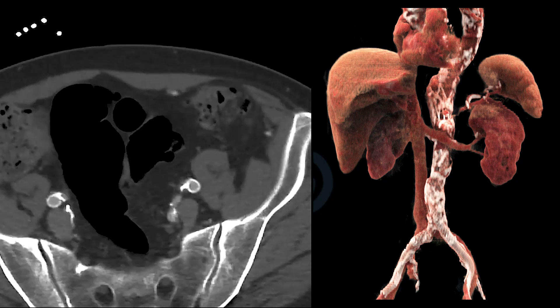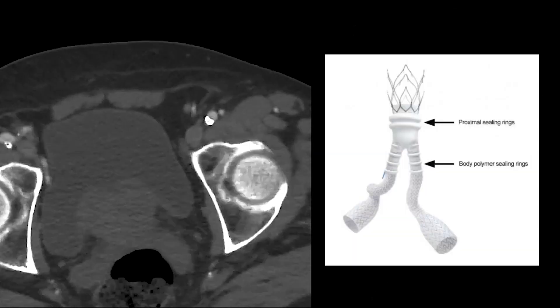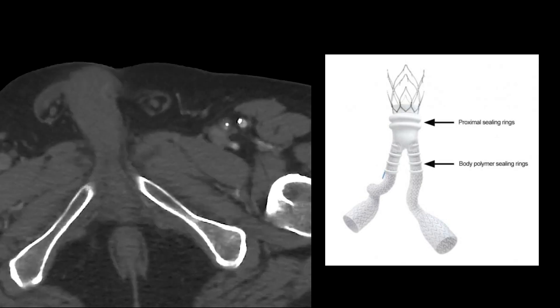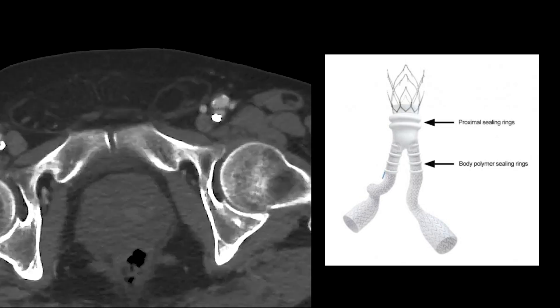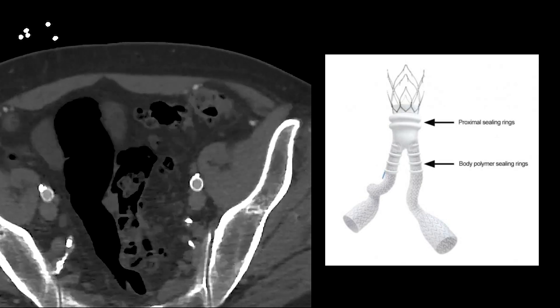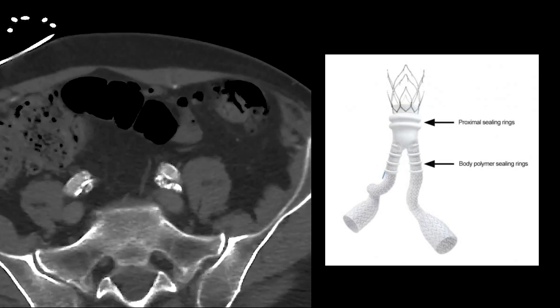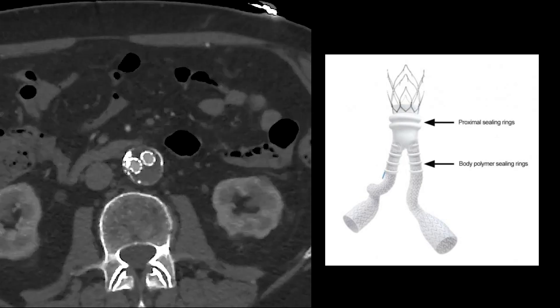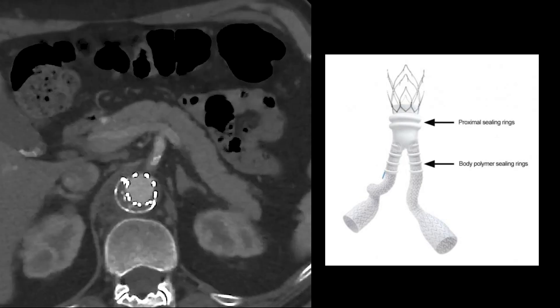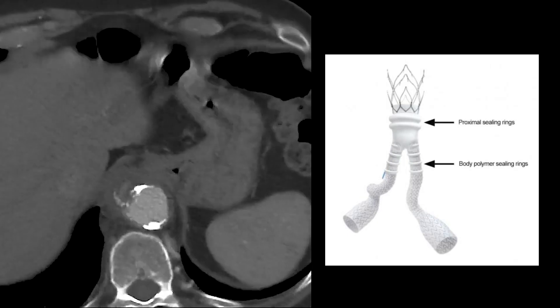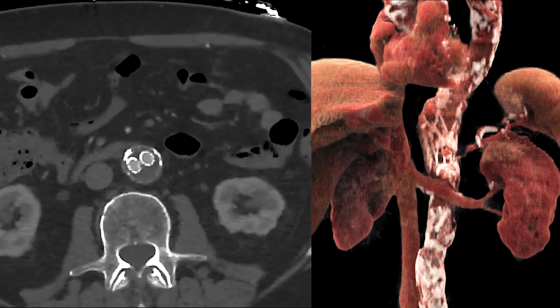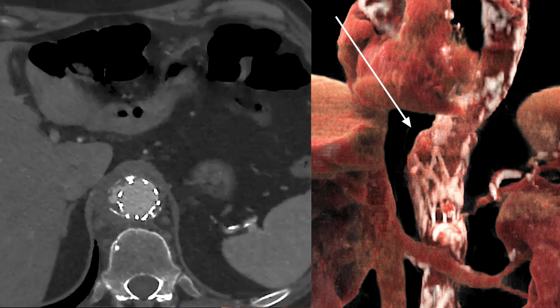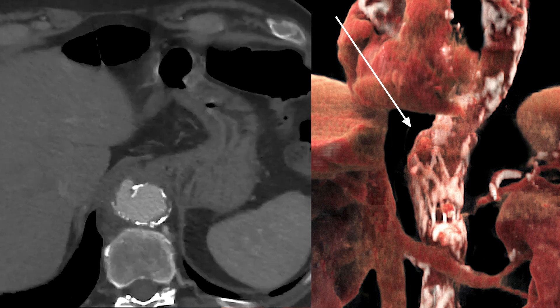The stent graft was an Ovation device, which has a radiopaque corona and limbs. The body itself, however, doesn't show on CTA or fluoroscopy. The proximal seal is achieved via filling the sealing rings with polymer. Preoperative CTA showed contained rupture above the level of the visceral segment.